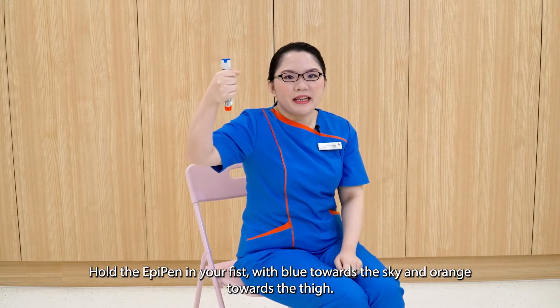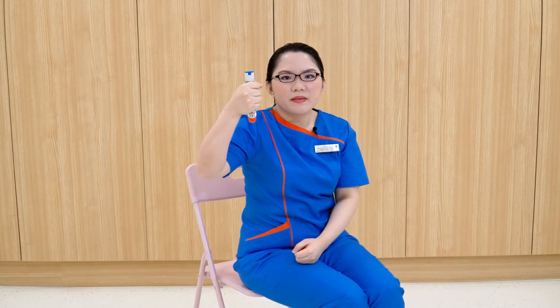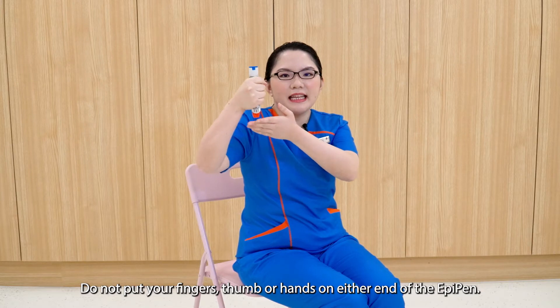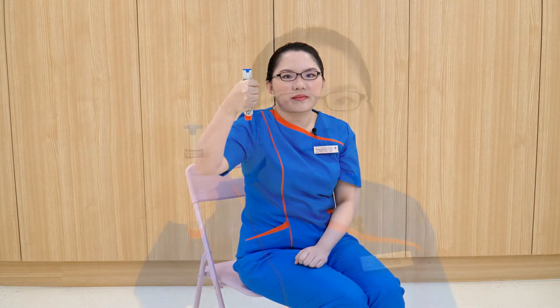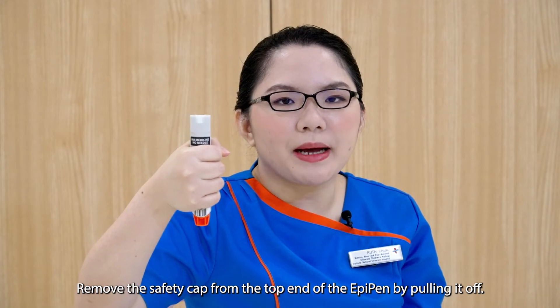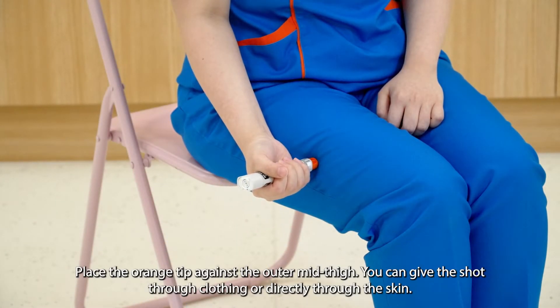Hold the EpiPen in your fist with blue towards the sky and orange towards the thigh. Do not put your fingers, thumbs, or hand at either end of the EpiPen. Remove the safety cap from the top end by pulling it off. Place the orange tip against the outer mid-thigh. You can give the shot through clothing or directly through the skin.